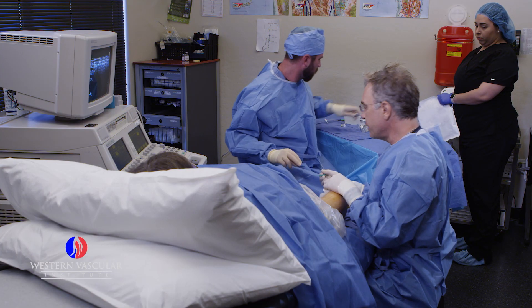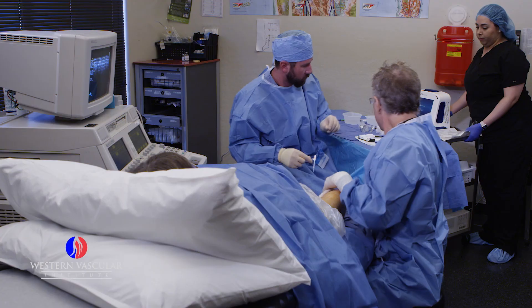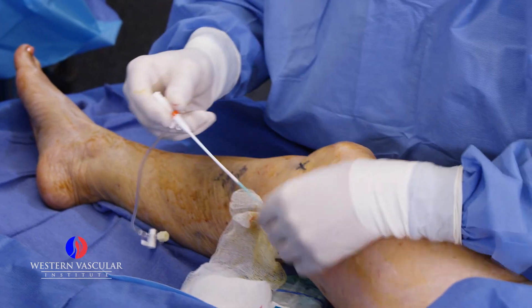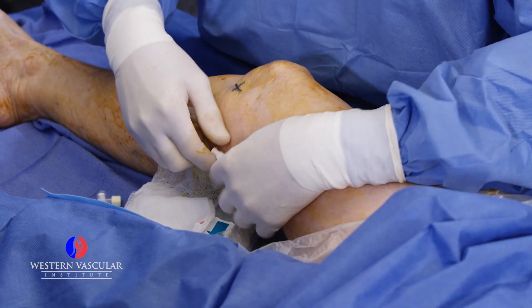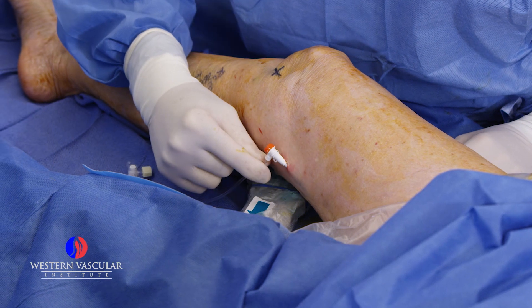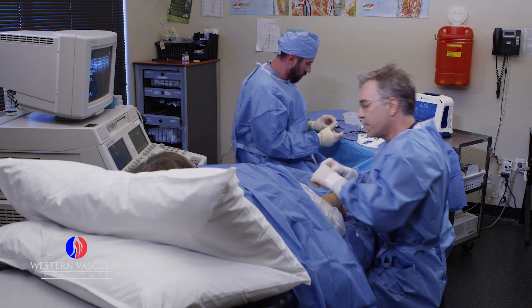We make a tiny nick in the skin to insert an access sheath — a little tube that gives us entry into the vein. We work through this tube, which has a small valve on the end, and the ablation catheter goes through that. The patient will feel just a little bit of pressure going into the vein. We then insert the radiofrequency catheter through the valve, which protects against any back bleeding into the area.